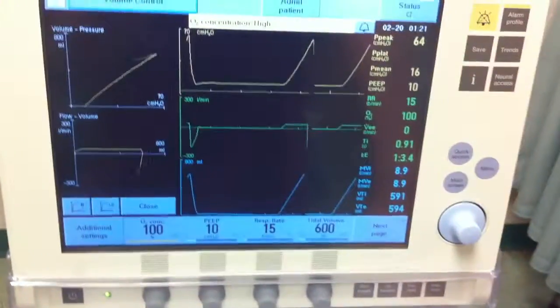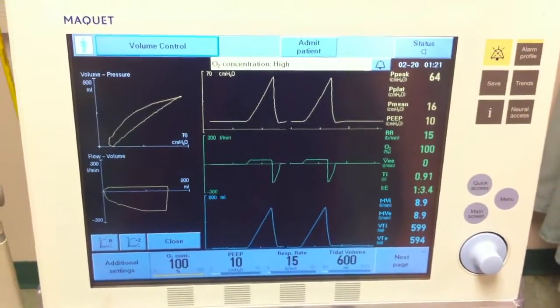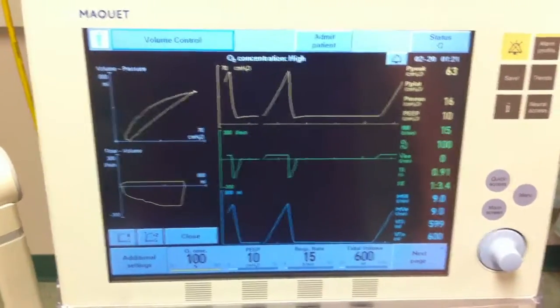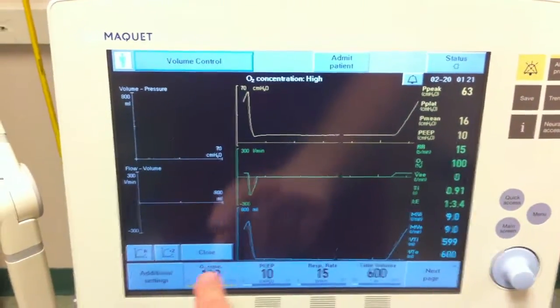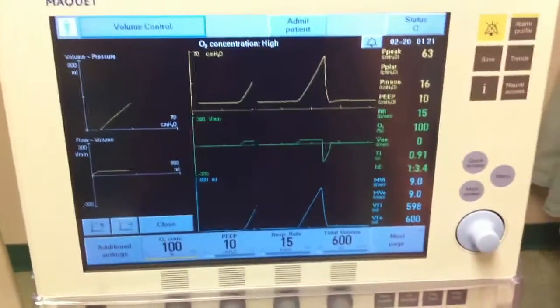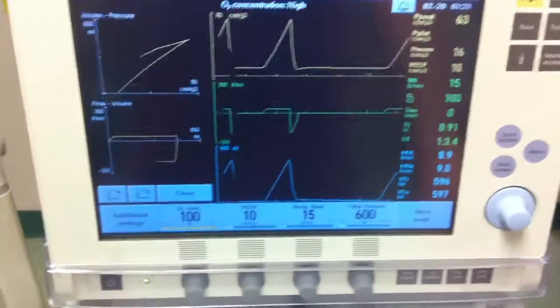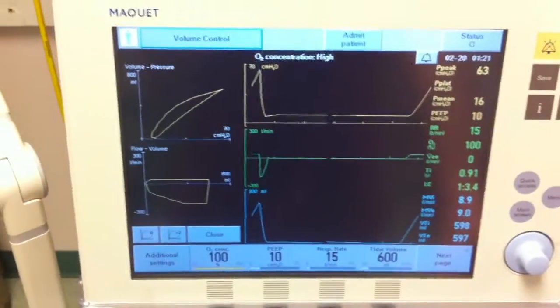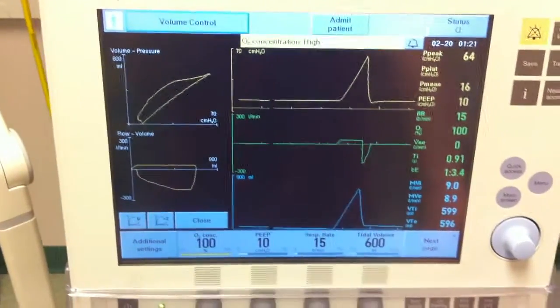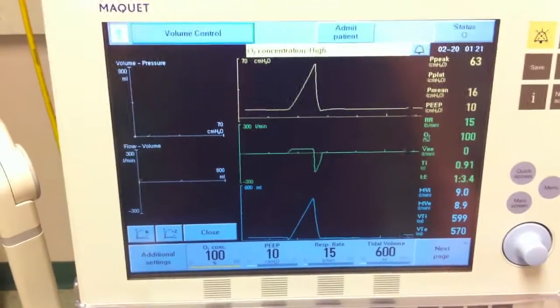However, during the patient's stay in the ICU, it was noticed that her arterial blood gases indicated refractory hypoxemia in spite of FiO2 being increased and in spite of high levels of PEEP. You currently find the patient supine in the ICU bed at the sending facility. They are requesting that you transport the patient to a larger level 1 trauma facility for care and pulmonology services unavailable at the same facility.